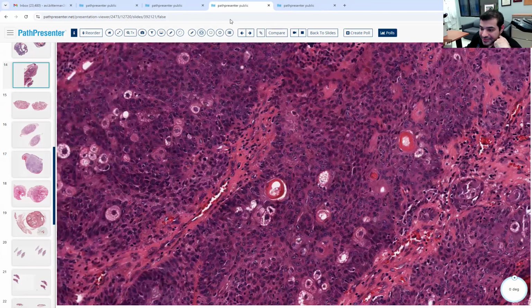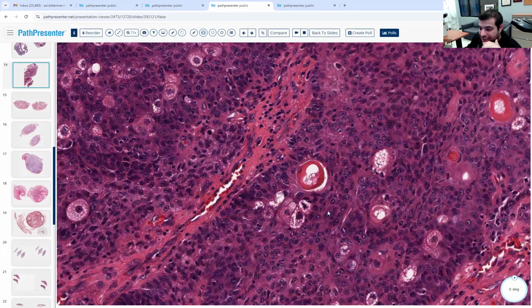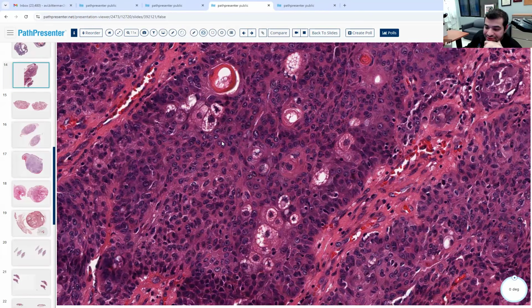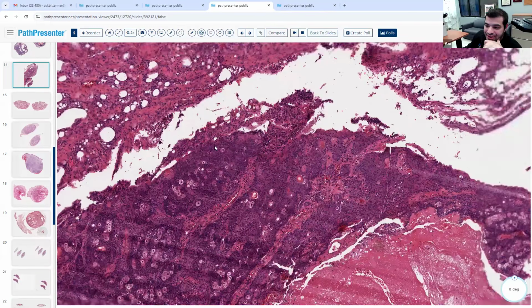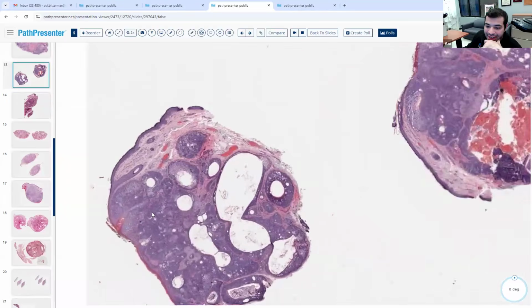There's also, and the other thing we're looking for, tell me about the cells themselves. Do you see any difference between the cells? See if we can find differences between the cells. If we were to just look at the cells here of these benign ones.